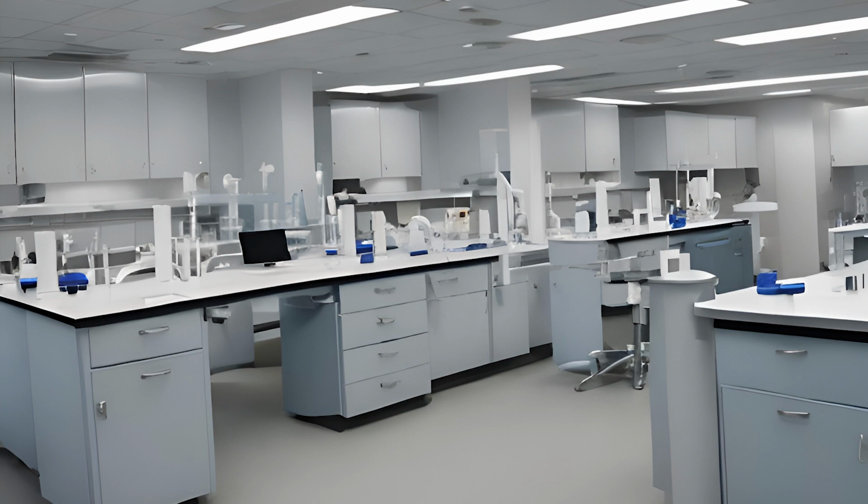If your patient seizes or convulses, you will immediately discontinue that draw. You're not even so worried about the tourniquet anymore. Your number one priority is you are going to get the needle away from the person that is seizing. They are at serious risk of injury if they seize up and start convulsing when there's a needle in their arm. At that point, it goes from being a safe procedure to something that is dangerous. You have to remove the needle from that scene.